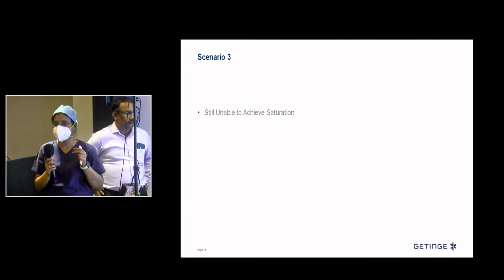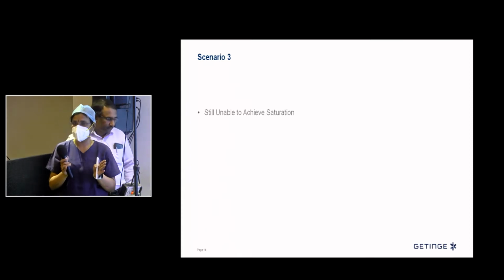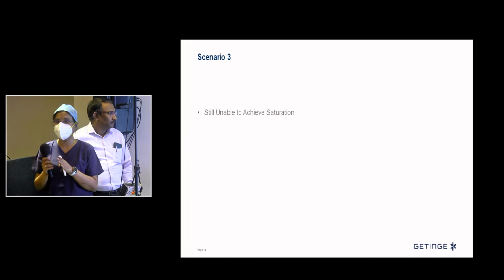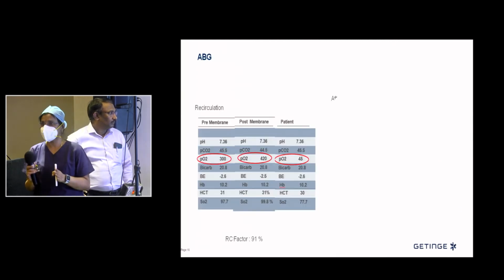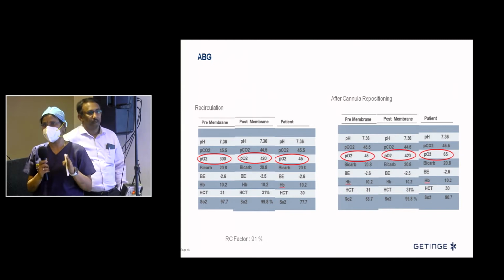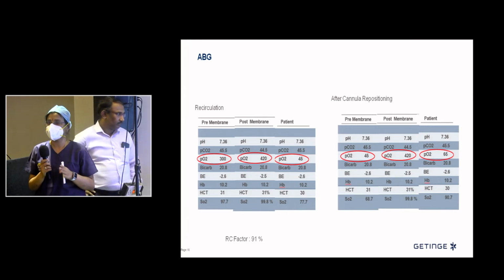See whether there is any kinking in the circuit. So see whether the oxygenator is functioning well, whether there are any clots in the oxygenator, visible clots in the oxygenator. Then come next, you see the post-oxygenator part, then see the color difference, then do an imaging of the patient, and that is how it is a stepwise approach, so that we don't miss the common things. And then finally recirculation, yes, definitely we need to tackle, but before that these are the practical things.